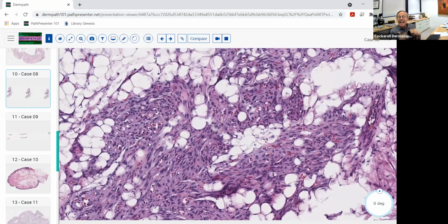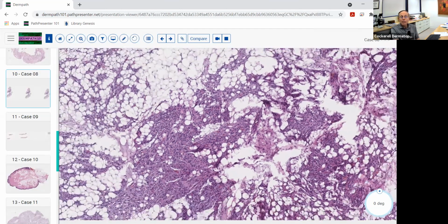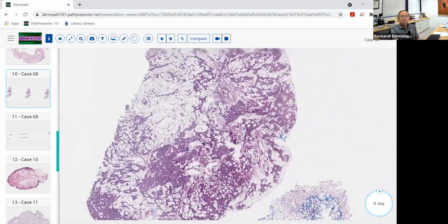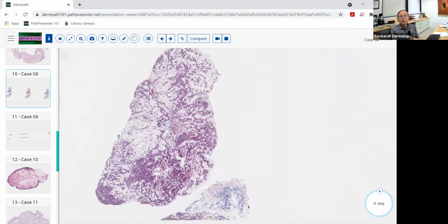And this is an angiolipoma. And you can see variable amounts of the angio component with an angiolipoma. This one's got a lot. This one's almost 50% of the vascular component and the fat component. In some cases, you can see up to 90% or more, where there's just mostly the vascular component with only a small amount of the fat component.